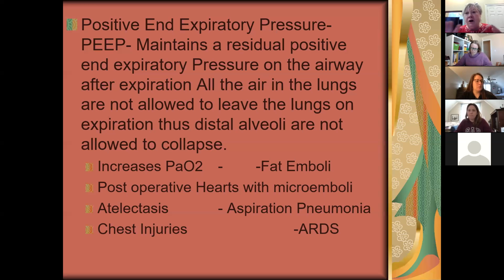Pressure support, they're doing all the work themselves, but we leave a little bit of positive pressure at all times in their airway so that they don't have to quite open the airways as hard by themselves. They're doing all their own breathing, just leaving a little bit of positive pressure in there. We're not giving them a breath. They're breathing on their own. Just a little bit of positive pressure. PEEP is only in expiration. The ventilator gave them the breath on inspiration, and then when they exhaled, left a little bit of positive pressure in there on expiration.